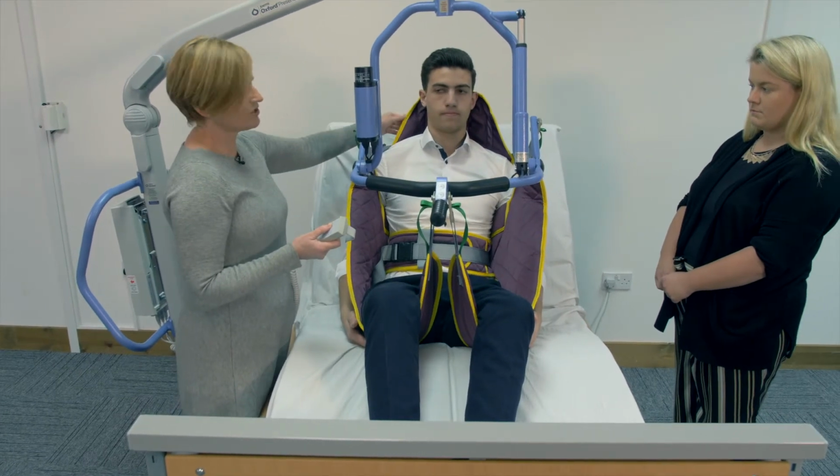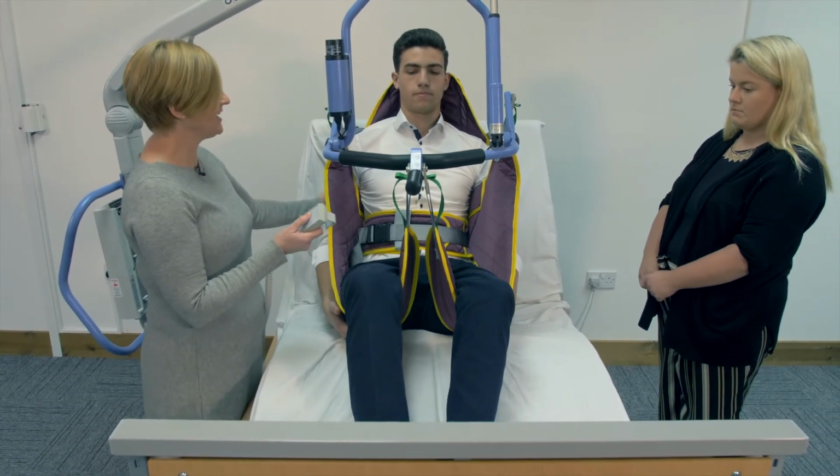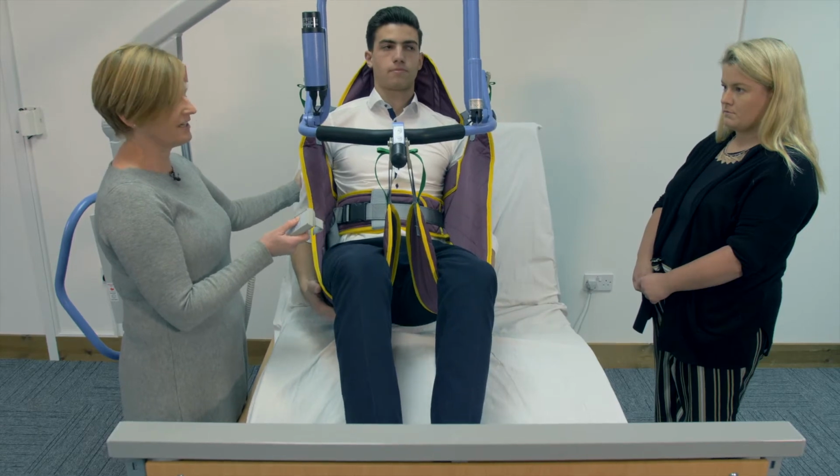The head support on the sling is providing the head support in a reclined position.